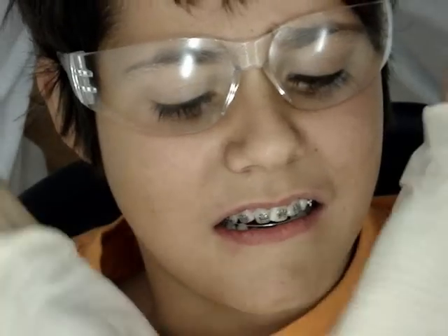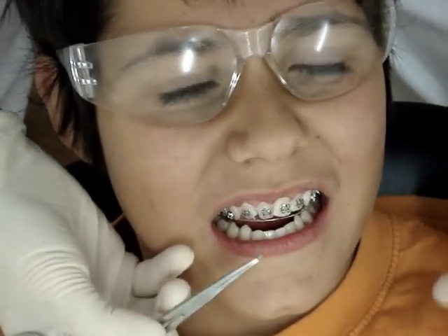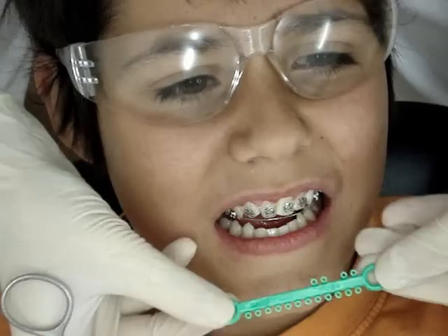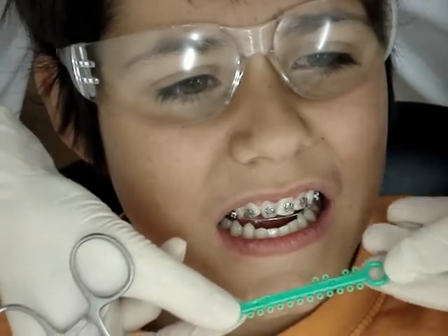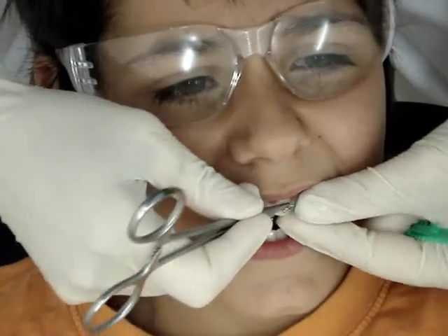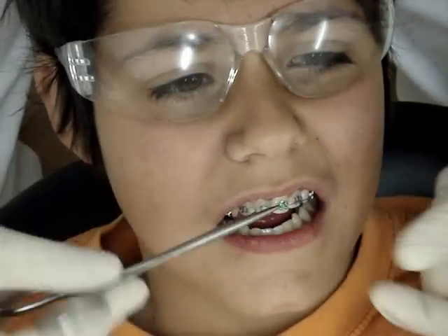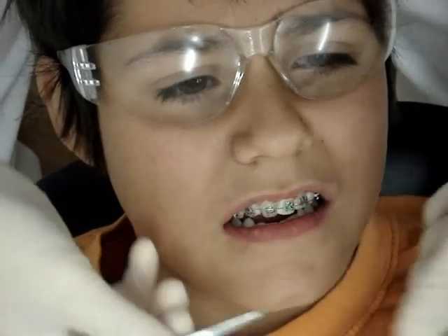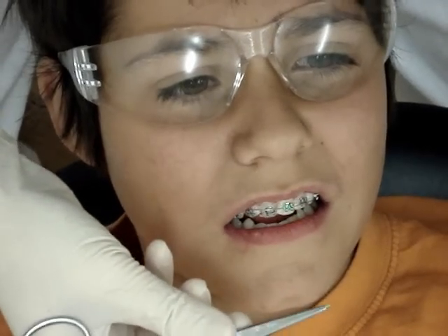So these are the modules — they're green this time — and they come on a plastic stick like this. I'm going to place them off one by one. I'm going to place them in X's. This instrument is called a mosquito.